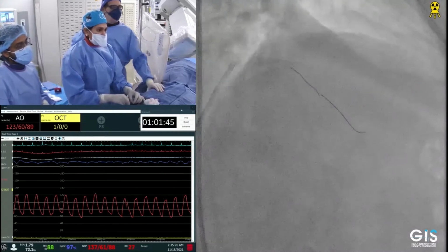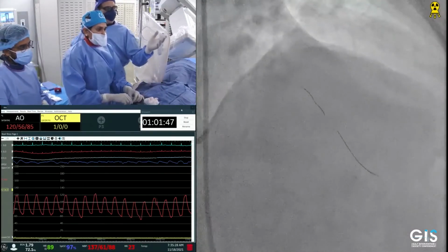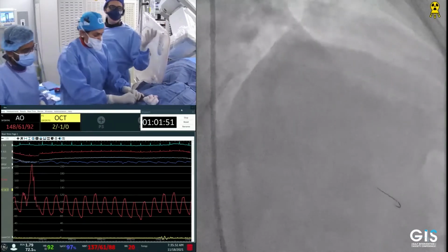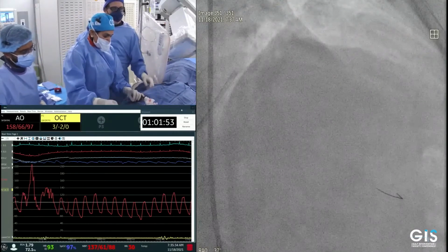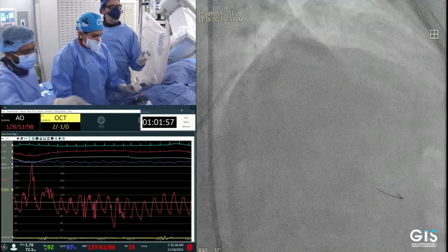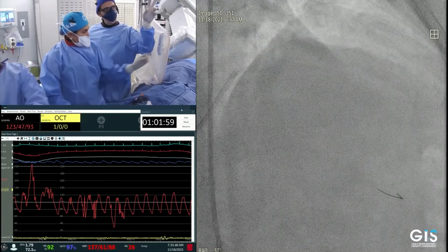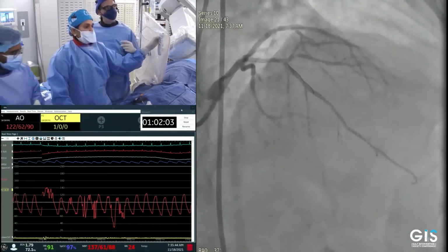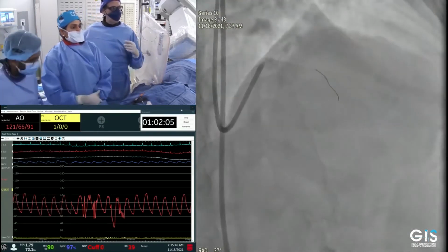Yeah, I mean, in the specific case here, there is no angulation, and in all honesty, any device could be utilized. One could also utilize orbital here, and you could also do the shock wave lithotripsy of the proximal LAD. No question about that.